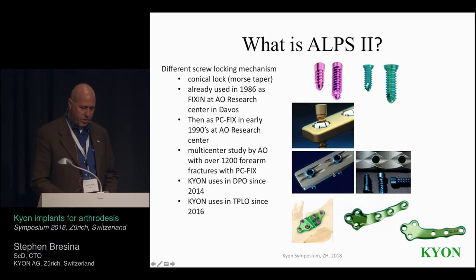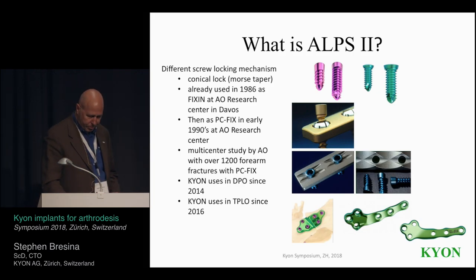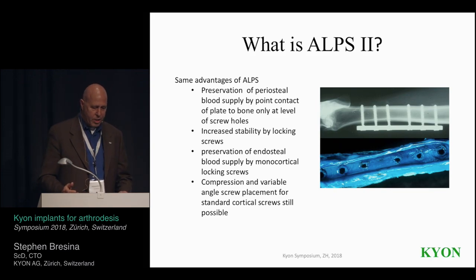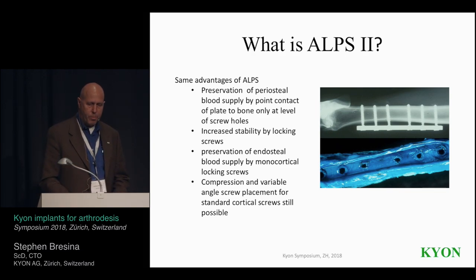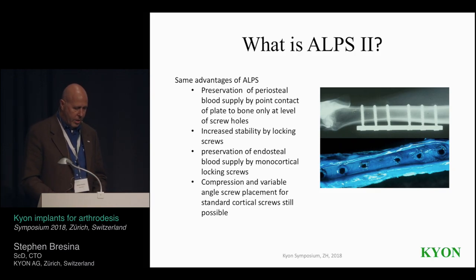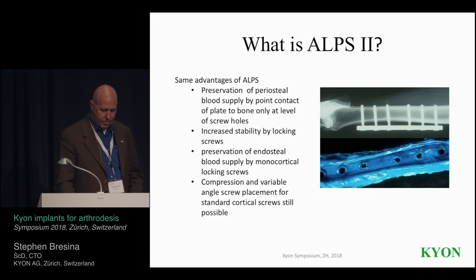A couple of reasons. One is it's easier to produce the plates, and there's less chance for surgical error of getting that screw cross-threaded as you started. But it has all the same advantages that you have with ALPS. ALPS 2 and ALPS both allow for preservation of periosteal blood supply. There's increased stability by having locking screws. There's preservation of the endosteal blood supply if you go with monocortical screws. And you can still use compression and variable angle screws with other little tricks, with sleeves, etc.